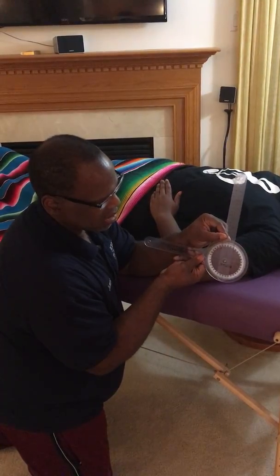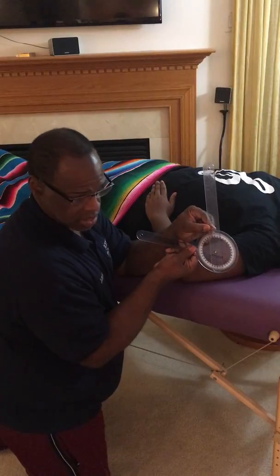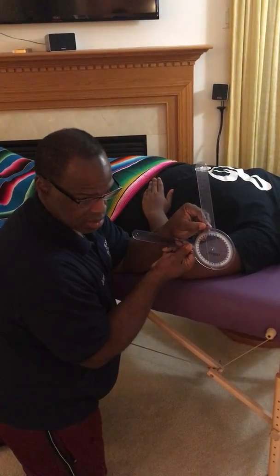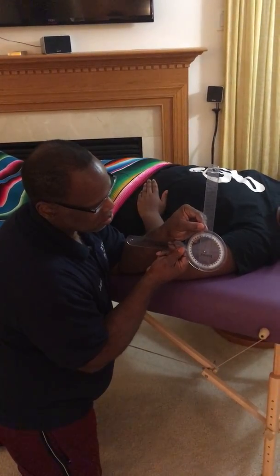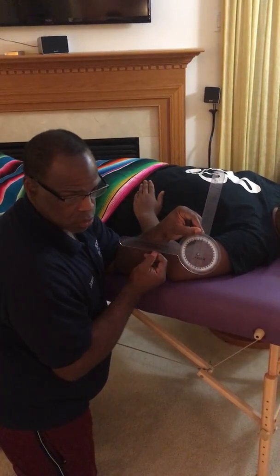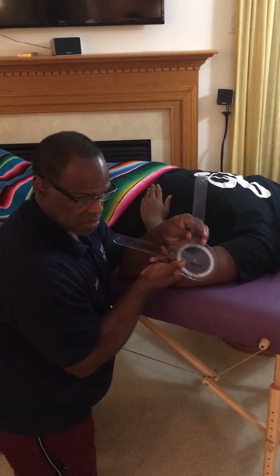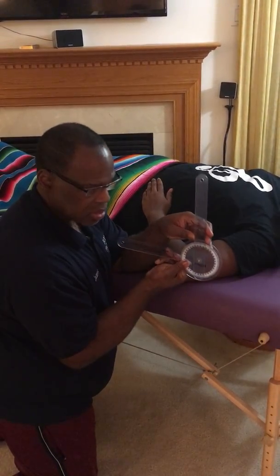If it went from the 90-degree number to the 80-degree number, then that person moved 10 degrees. All right, and then vice versa. If it went from the 90-degree number to the 100 degrees, again, the person moved 10 degrees. All right, this would be the neutral starting position, of course, for internal and external rotation of the shoulder.